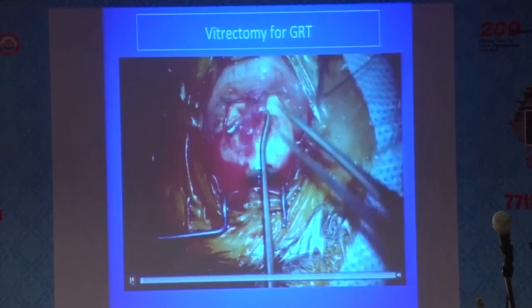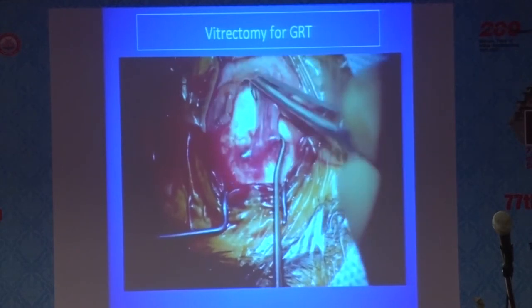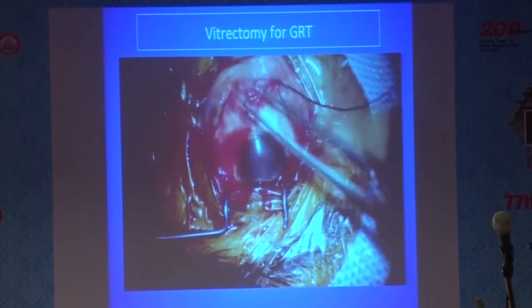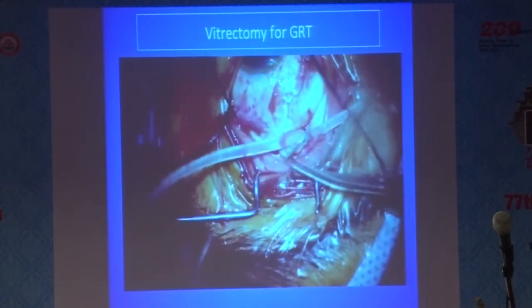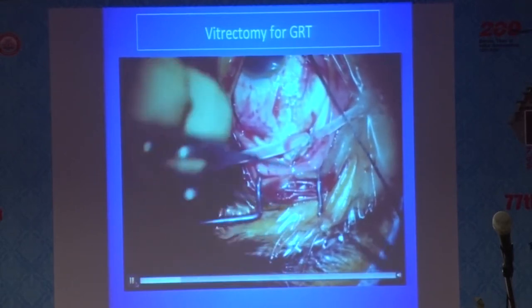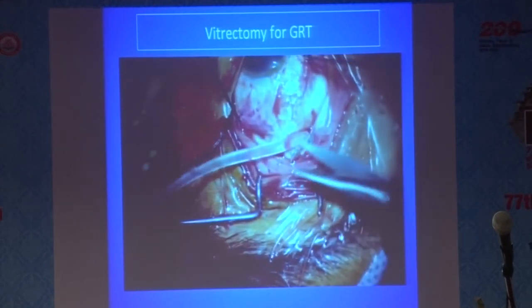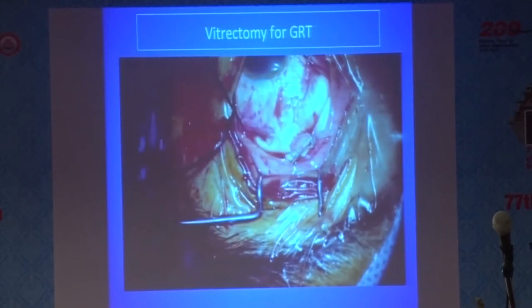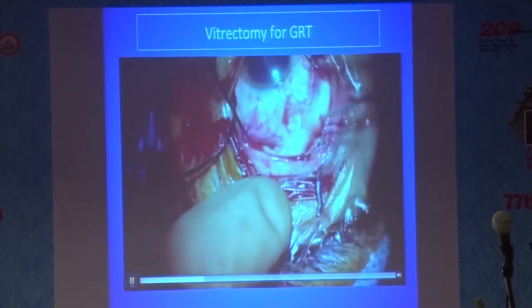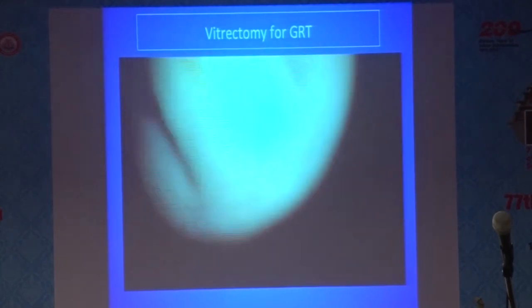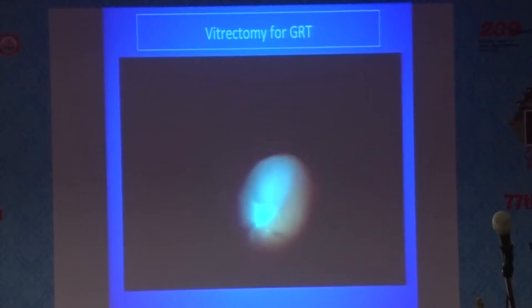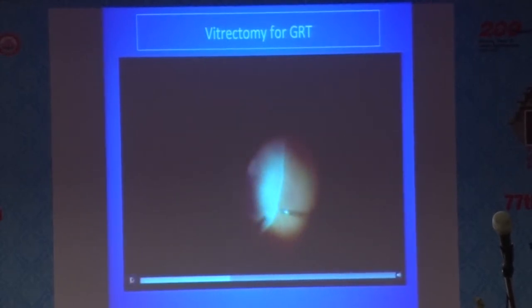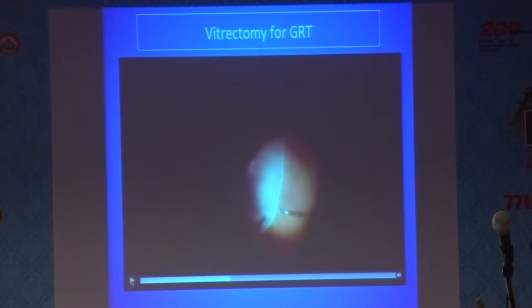I will now show two small videos. We begin with a 360-degree peritomy when planning to add a supplementary buckle. As you can see, this is a phakic patient. This is followed by bridling all the recti, and we generally use only a 240 band — no tire in these patients. Standard sclerotomy ports are made at standard distances from the limbus. We are now using 25-gauge instrumentation because the instruments have become stiffer and easier to manipulate. We also now have very high cut rates — from 7,500 up to 10,000 cuts per minute. After making the sclerotomy ports, we start with core vitrectomy, done at high cut rates and slightly lower aspiration, because the edge of the GRT is very mobile and can come into the cutter.